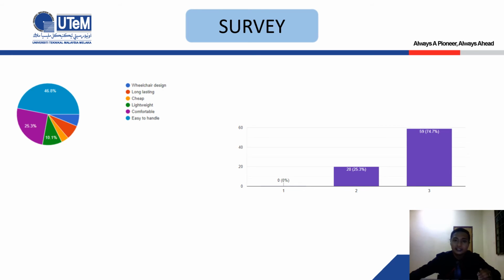On the other hand, in section C, to complete the house of quality, some other data is needed to plot a weight score to fill the plot boxes. Respondents were asked about the level of importance of some requirements towards the manual wheelchair, such as material quality, strength of the material, design concept, color and material use.